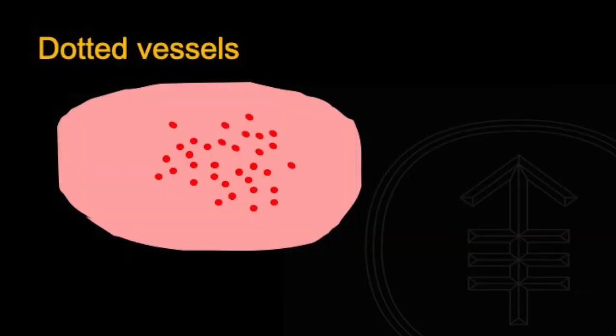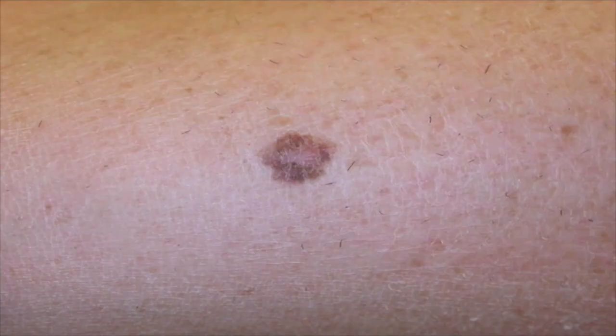So first, dotted vessels, lesion on the leg. Under standard light dermoscopy, putting it on with alcohol, putting it up against the skin, I see nothing. I take the pressure off and bingo, there they are, little dotted vessels. In addition, notice they're also early shiny white structures, right? Very early. They often occur together, but so there's a little serpentine vessel and dotted vessels, melanoma.